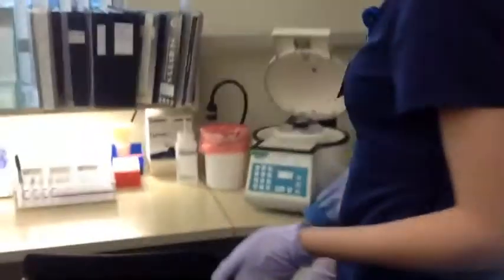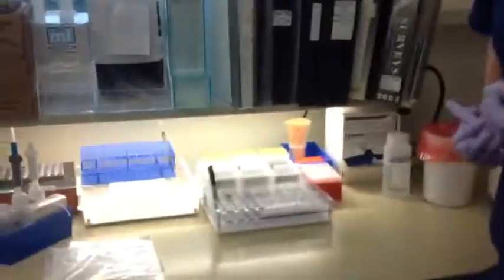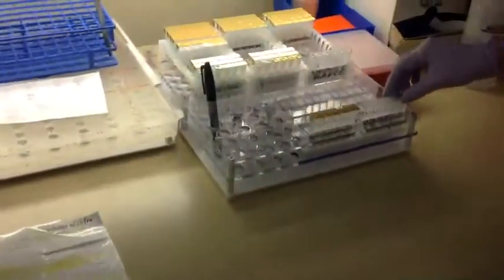To actually do the testing for transfusion, we would do a blood type, an antibody screen, and a cross match. And this is actually how we do it. These are our gel cards that we use. And these are our reagents.